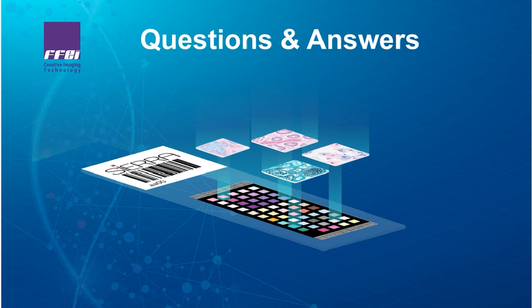That's a very interesting question, actually. So the answer to that is we do have various data on and off in terms of scanner manufacturers' own colour correction technology, and it's quite interesting to see the variations. Some are much better than others. It's not data that we typically publish, but generally the scanners are able to provide raw data which we can use to check the calibration, but they also in many cases have their own colour calibration technology. And so the answer is yes, we generally can assess the colour calibration of scanner manufacturers' own viewing technologies.